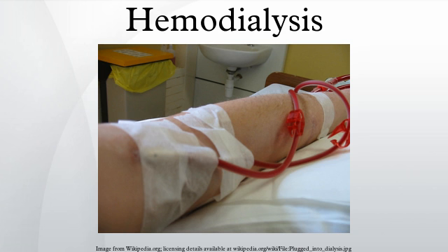The blood is then pumped through the dialyzer, and then the processed blood is pumped back into the patient's bloodstream through another tube. During the procedure, the patient's blood pressure is closely monitored, and if it becomes low, or the patient develops any other signs of low blood volume such as nausea, the dialysis attendant can administer extra fluid through the machine. During the treatment, the patient's entire blood volume circulates through the machine every 15 minutes. During this process, the dialysis patient is exposed to a week's worth of water for the average person.